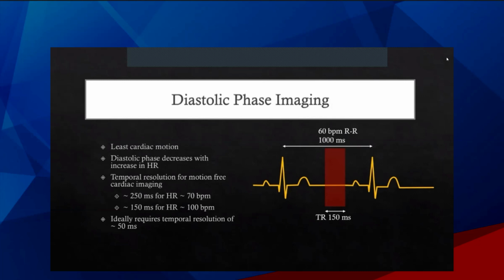Even with faster heart rates and decreasing diastolic phase duration, you can still get diagnostic quality images if multi-segmented techniques are used. It is important to note that if your patient has significant arrhythmias, including atrial fibrillation, and patients with fast heart rates, acquiring images at end systolic phase might be more beneficial.